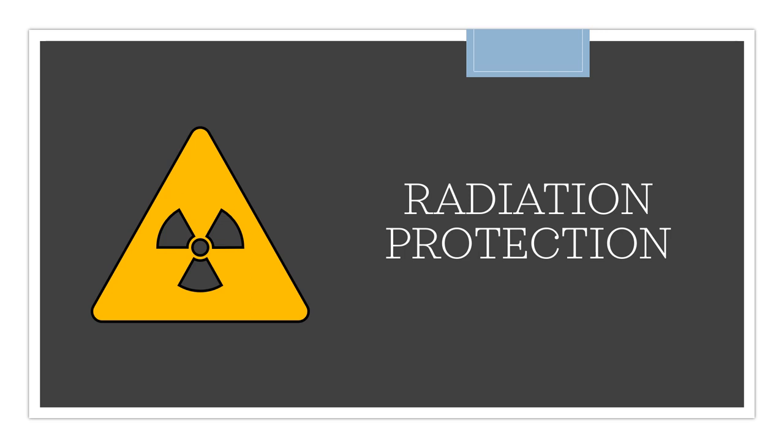Was the exam explained to the patient? Were clear, concise instructions given? Immobilization devices. Were immobilization devices used to prevent patient motion when needed? Source to skin distance, SSD. Was the minimal SSD of at least 12 inches maintained for mobile radiography? Pregnancy. Was the possibility of pregnancy determined on all females of childbearing age? Gonadal shielding. Is the gonadal shielding evident and accurately positioned when the gonads are within the primary beam and shielding will not cover the volumes of interest?